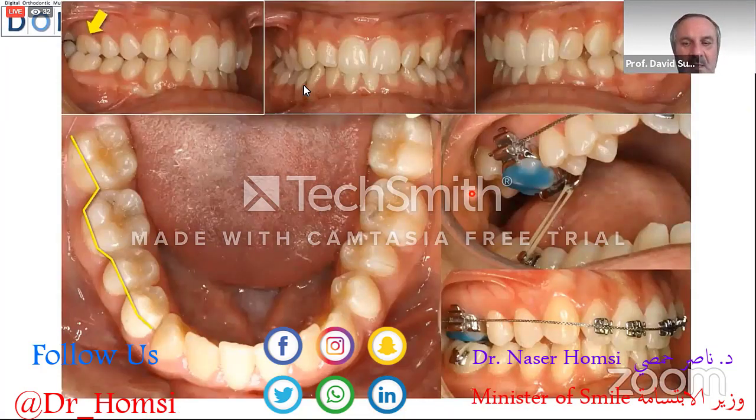Another patient with a crossbite, okay? The crossbite on the right. And we need now, for the crossbite, to put the elastic in the upper and in the lower.